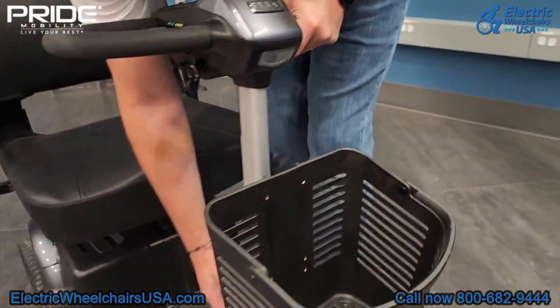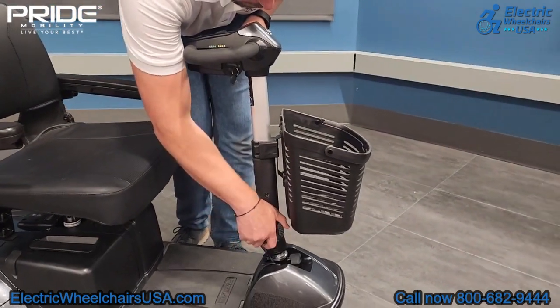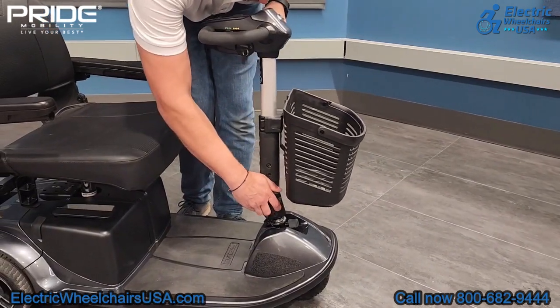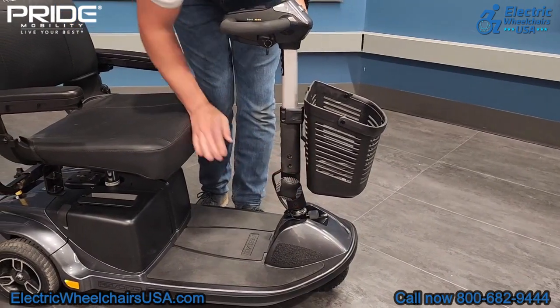The tiller is also adjustable, so you can adjust it towards you or away from you, so you get to a nice driving position that's comfortable for you. You just adjust this knob, and that will loosen the tiller so you can put it in a good position for you, and then tighten it once you get to that position that is comfortable for you.